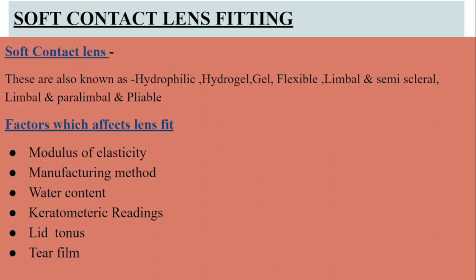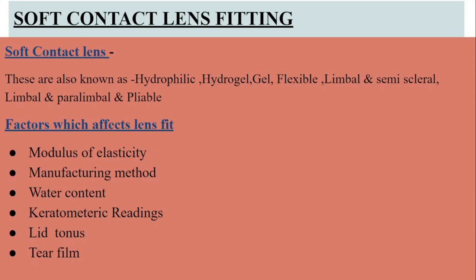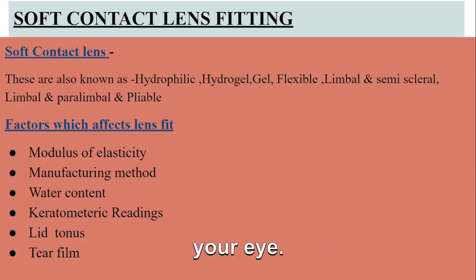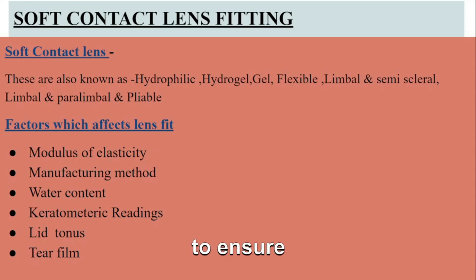Number five, lid tension. The strength of tension of your eyelid, known as lid tension, can influence how the contact lens sits on your eye. Your eye care professional will assess your lid tension to ensure that the lens fits properly and does not cause any discomfort or movement.